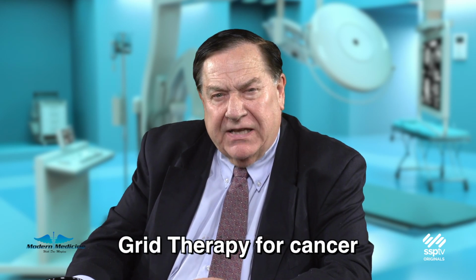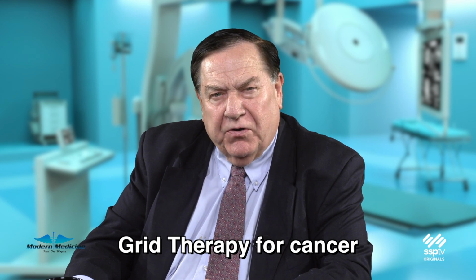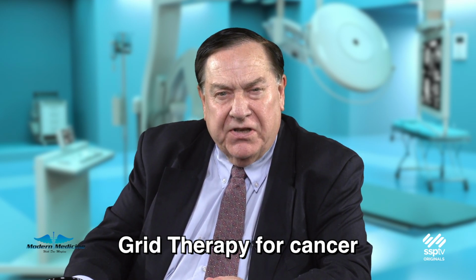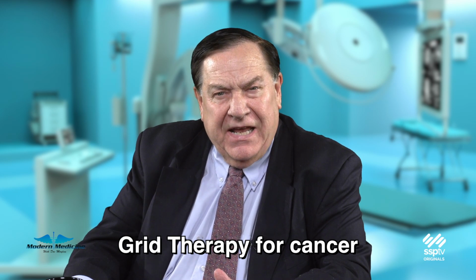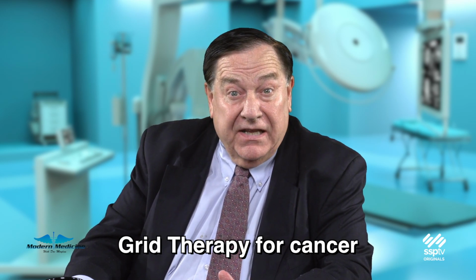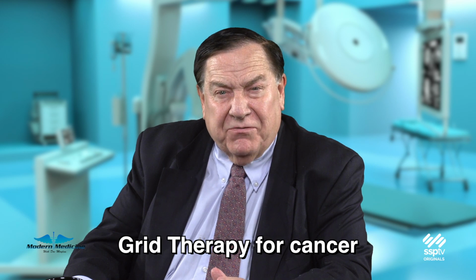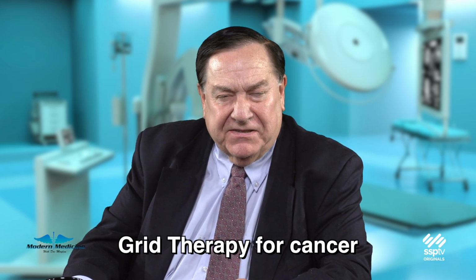Also, 25 years ago, we initiated a program at the Kramer called grid therapy. What is grid therapy? Well, that's what this movie is going to explain to our viewers. It's basically a special filter on the radiation that allows us to give what I would call priming doses of radiation to tumors that are on the larger size. Once a tumor gets to a certain dimension, the blood vessels in the tumor are abnormal, and there is improper delivery of oxygen to the cancer cells. Without oxygen, cells become resistant to the effects of radiation, the anti-tumor effects. So this grid therapy allows us to overcome that resistance.